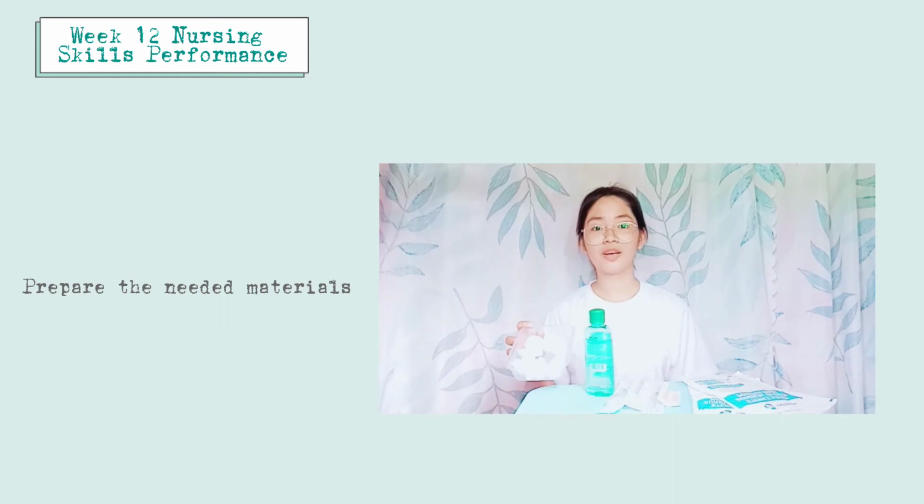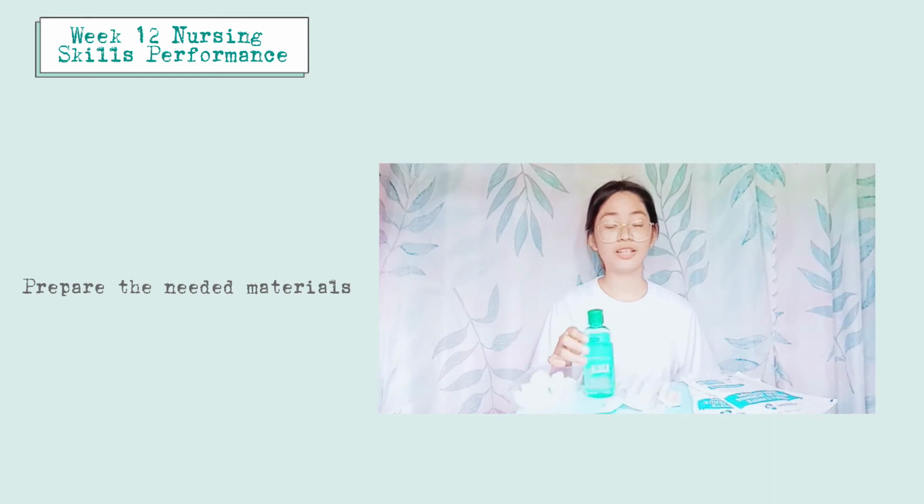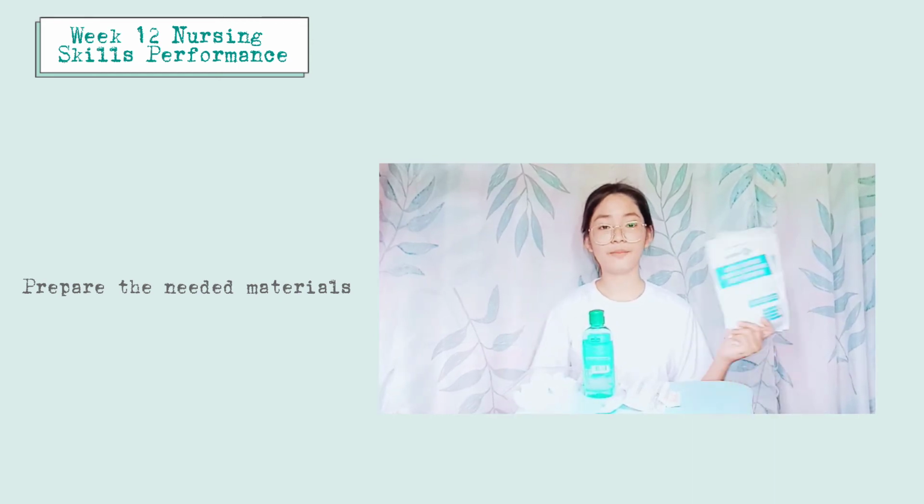We'll be needing an ampule or a vial containing the right medication, a sterile tuberculin syringe, a needle like this, a cotton swab saturated with antiseptic solution, alcohol for sanitation, and lastly a pair of gloves.